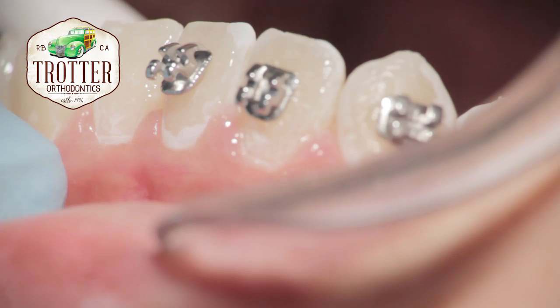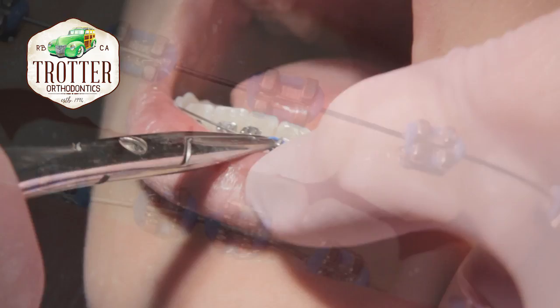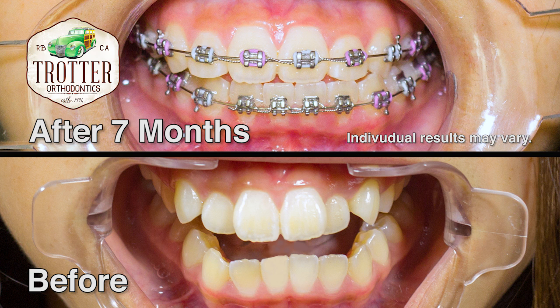The same procedure is used to place brackets on the lower teeth. The picture above shows the patient's teeth seven months after the initial placement of the upper brackets. Generally, braces have to be worn from 18 months to two years or longer, depending on one's dental condition.